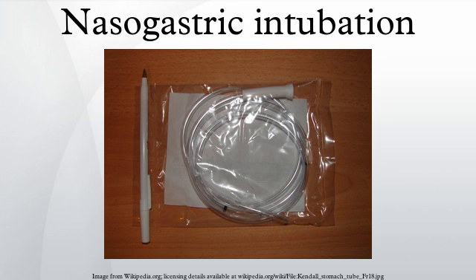If the tube is to remain in place, then a tube position check is recommended before each feed and at least once per day. Only smaller diameter nasogastric tubes are appropriate for long-term feeding, so as to avoid irritation and erosion of the nasal mucosa. These tubes often have guide wires to facilitate insertion. If feeding is required for a longer period of time, other options, such as placement of a PEG tube, should be considered.